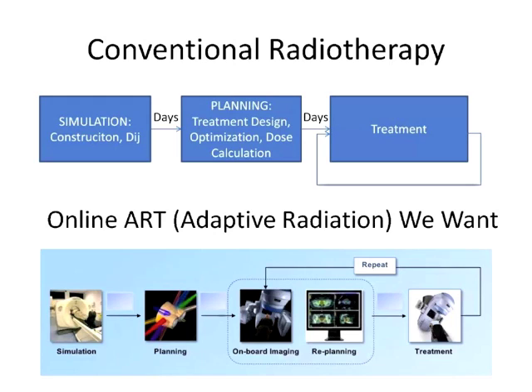And if you look at this repetition, you don't have any feedback routines on how the tumor is shot with the source, or how the tumor has changed on the day of the patient's arrival. Those things are not considered because of the slow tool response time. So we assume everything is the same, and we just keep repeatedly treating the patient.